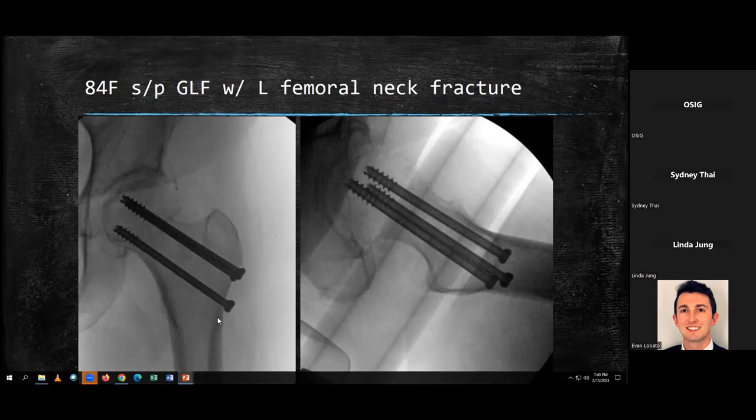And so what happens is, the top part of our fracture here, the femoral head, we have purchase there, no purchase here, and then the femur. What you would expect is if you kept dragging the screw, the screw would just keep going on and on and out into the pelvis, into a bad place. But the head of our screw here can't get through the cortex because it's bigger than the hole that you drilled.